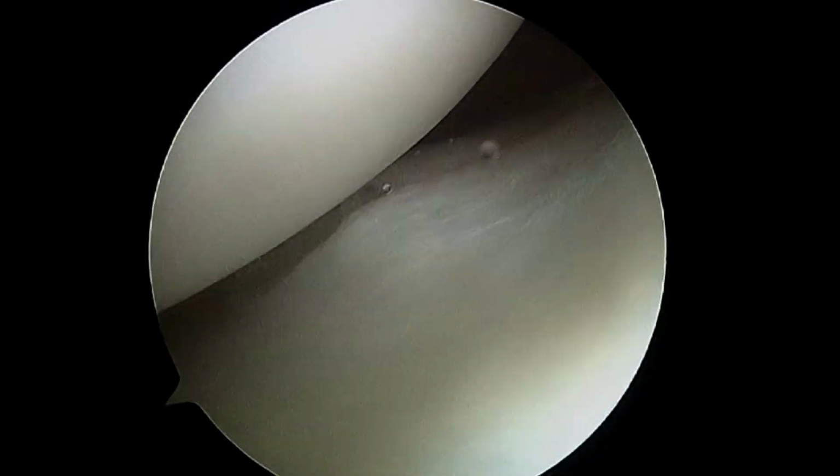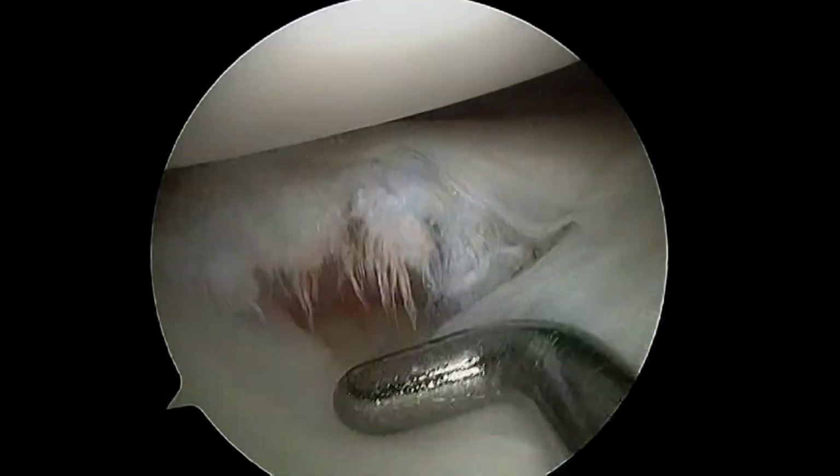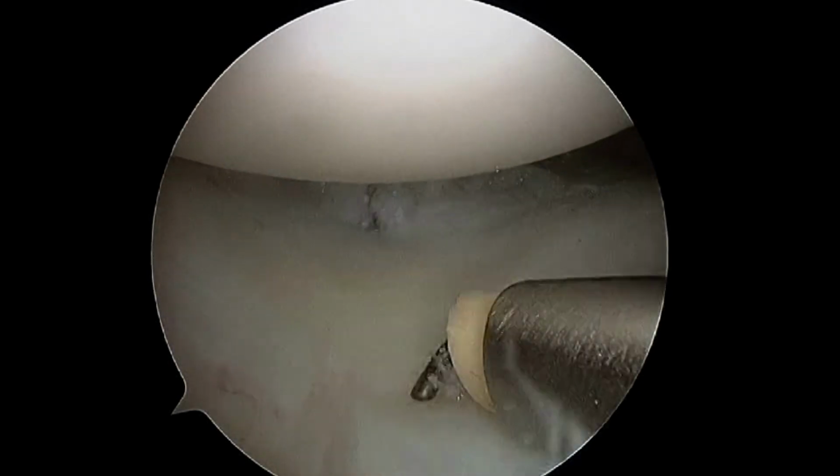In this case we present a video of a 23-year-old female, who presented with pain and catching in the lateral compartment. The arthroscopy shows a complete discoid meniscus which is occupying the entire lateral compartment, and a tear can be identified near the posterior third. A hook radiofrequency probe is used to mark and cut the central portion. The hook is valuable and it makes the anterior work simple.